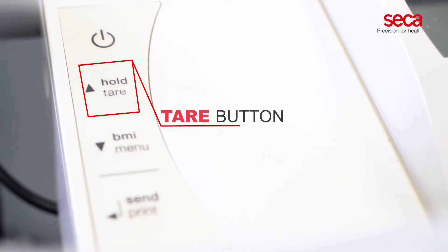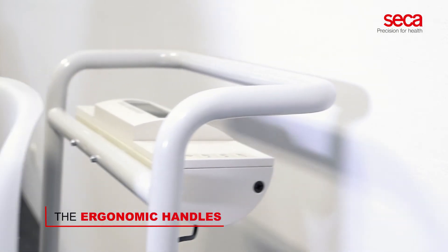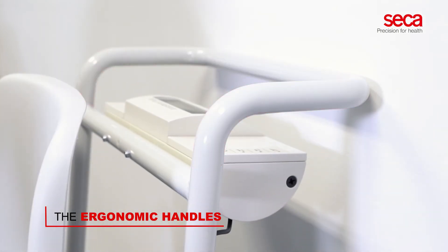With the tare button, the scale allows you to exclude the weight of an additional item, such as a blanket or a cushion. The ergonomic handles allow easy maneuvering and they protect the display unit during accidental mishandling.